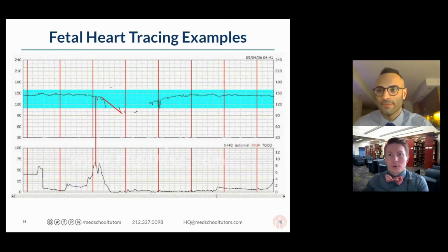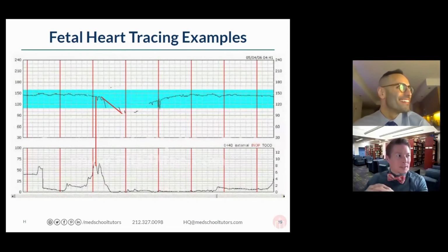What do we follow the non-stress test up with? If the non-stress test fails, if it's not reactive and we've woken up the baby and that's not the reason anymore, what are we going to do next after the non-stress test to evaluate fetal well-being? Ooh, lots of really good answers. Nice. So I'm seeing a lot of people say BPP, which is biophysical profile.